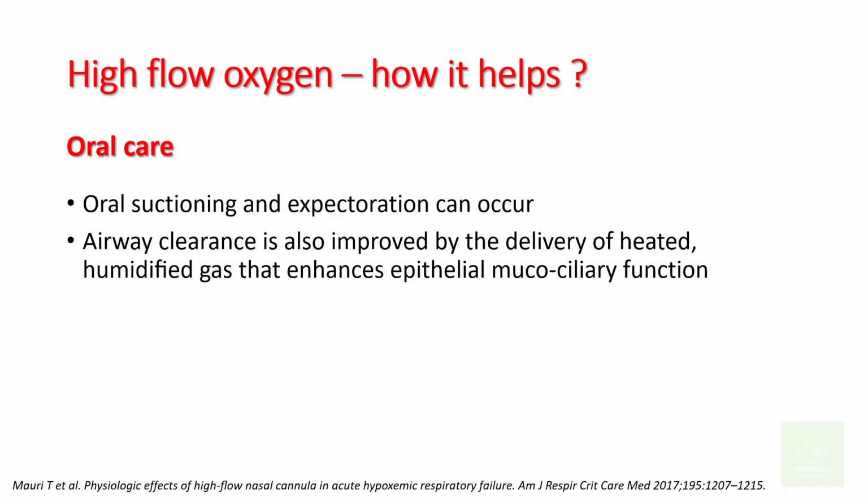Another utility of high flow oxygen is that oral suctioning and expectoration can still occur, which cannot be done if the patient is on non-invasive ventilation. Also, airway clearance is improved because the heated humidified air enhances epithelial mucociliary function.